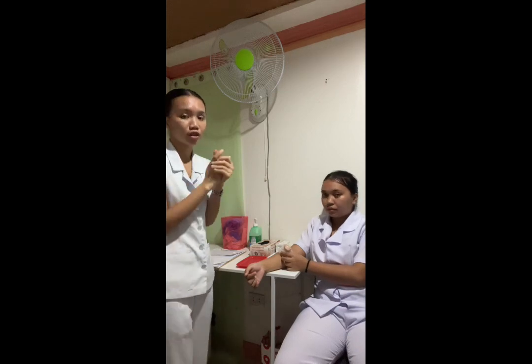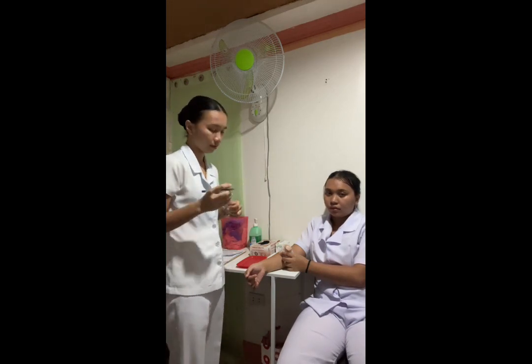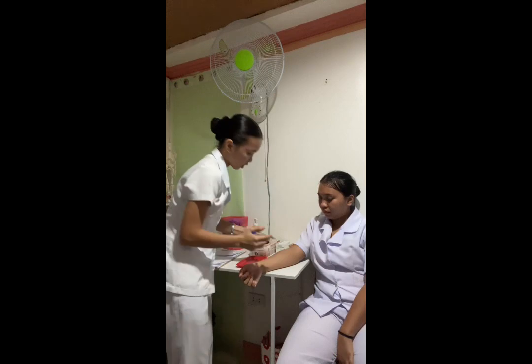And then afterwards, we're going to encircle the injected site with ink to observe for any redness or induration or hardening per agency policy, to allow easy identification of the injected site. So, going to encircle the injected site.